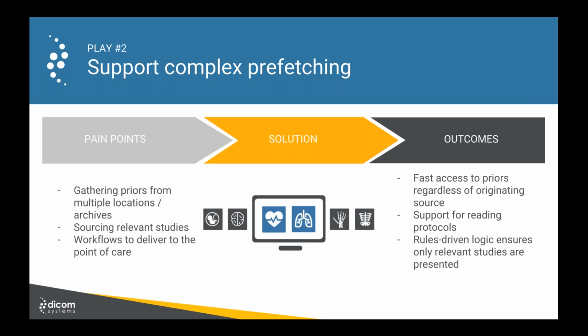And because our hospitals are not in a single IDN or in a single large hospital group, we have inconsistent data among all of our hospital sites. So procedure descriptions, procedure codes, they are not consistent. Dicom modality worklist is sometimes adopted, sometimes partially adopted, sometimes not that well. And the challenge we were facing with Prefetch was getting the right images, the right priors, in the amount of time that we had to get them.